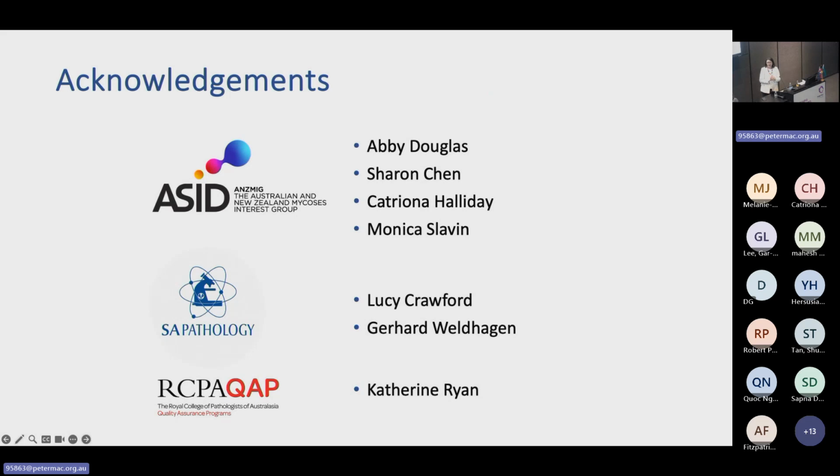So it is technically regarded as a custom plate, and research use only, but it is available in Australia. My lab uses it routinely, for everything. I think Westmead also do, and there are probably 5 or so labs using it. Are they clinical breakpoints, or is it wild type, non-wild type? I don't think there are any isavuconazole clinical breakpoints yet. Great, excellent. Thanks so much, Sarah, for your presentation.